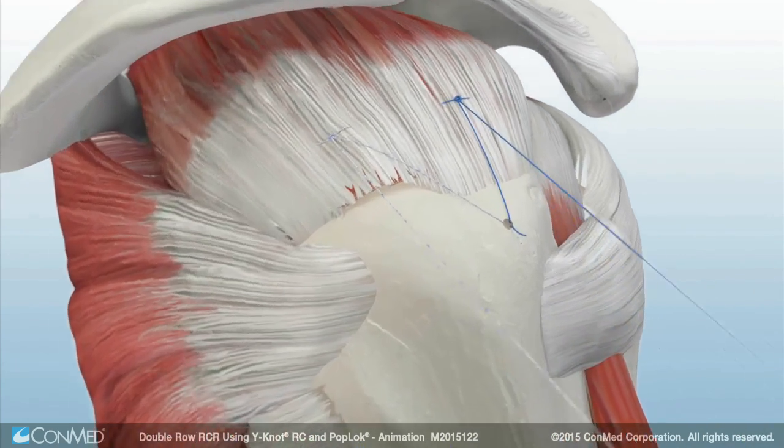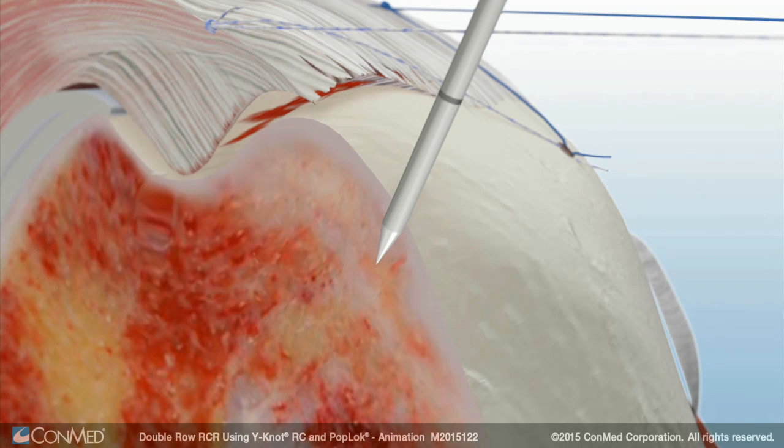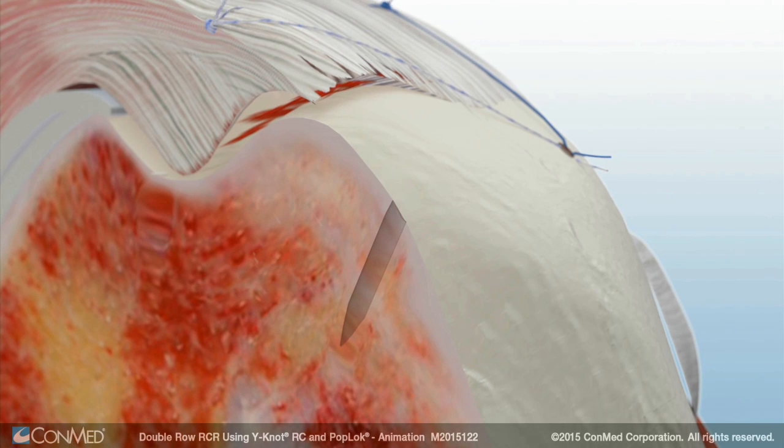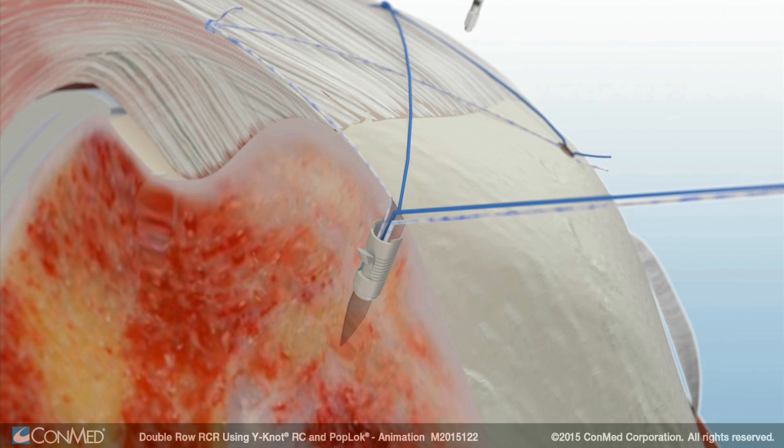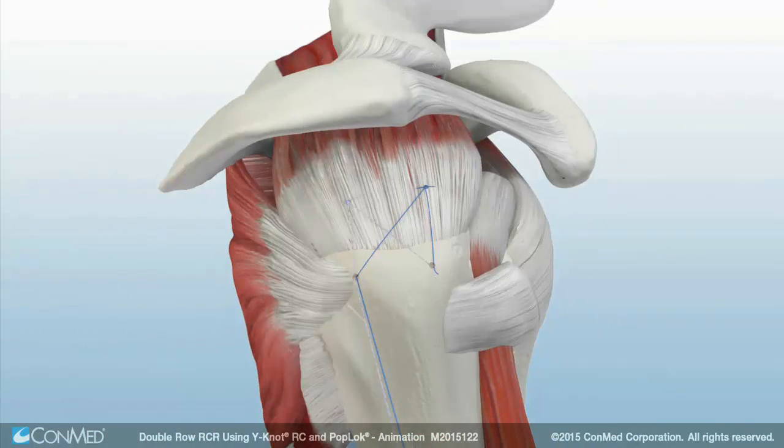A second punch and anchor are inserted. The pop-lock locks the suture within the anchor and features subcortical wings for secure and reliable fixation. Cut the remaining suture tails to complete the repair.